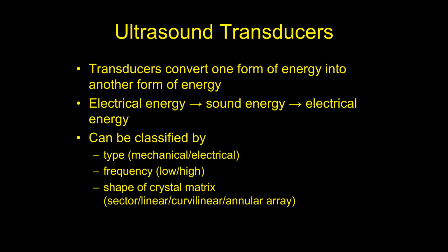So let's go to transducers. Okay, what is a transducer? A transducer is the probe that you hold in your hand when you're doing an ultrasound. And a transducer is an electronic device. Basically, it converts one form of energy into another form of energy.